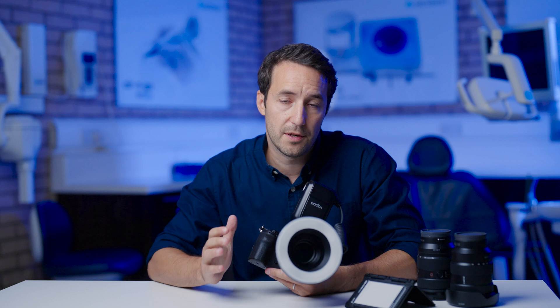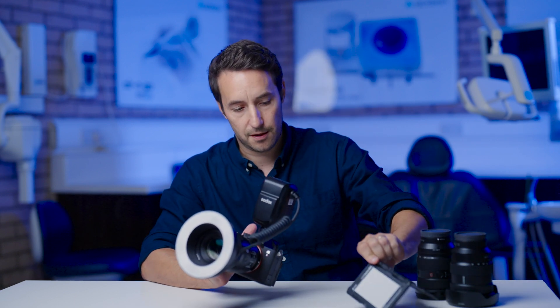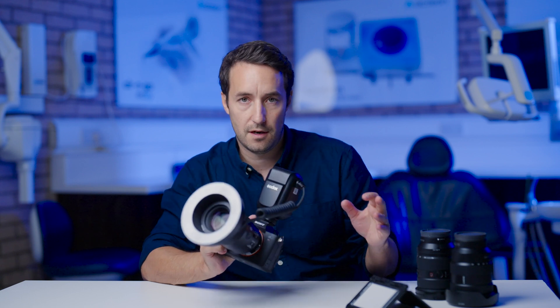To do this, I'm going to be using an X-Rite colour checker and the Sony a7R IV.